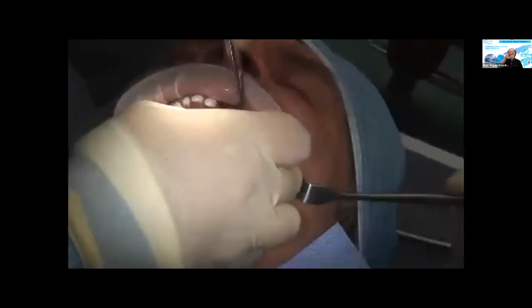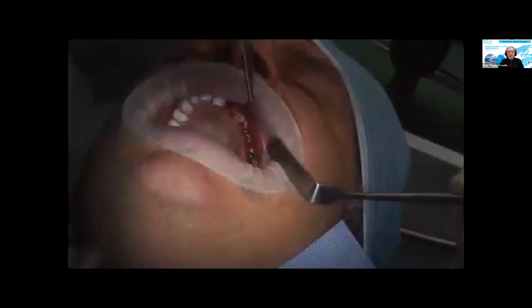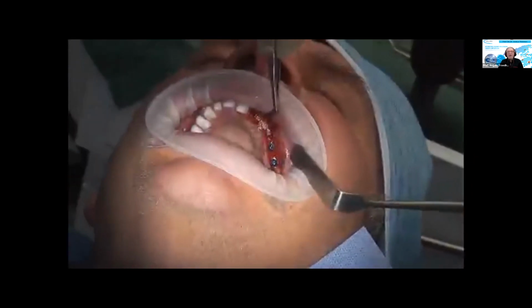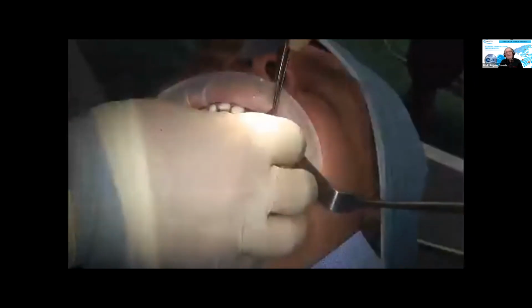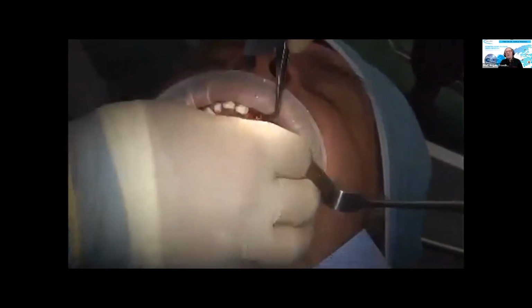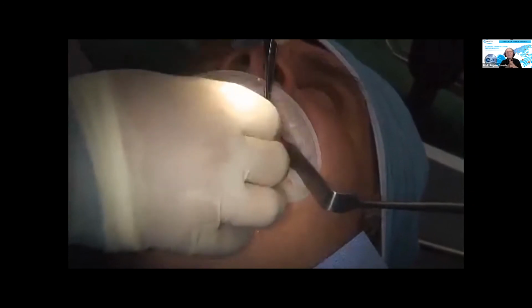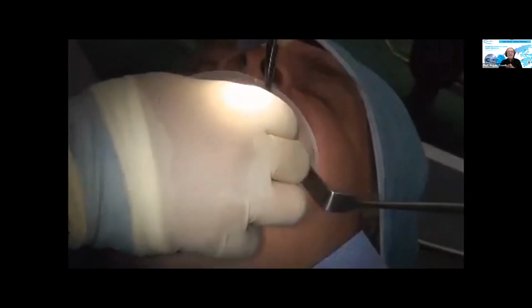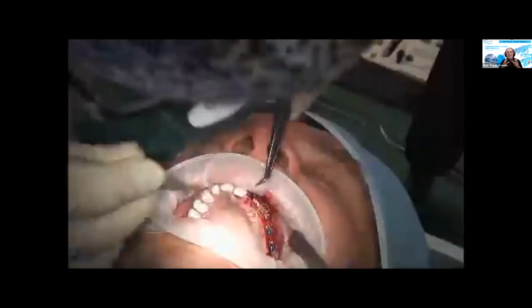Now, of course, in between the two inserted implants in the crest split, we mostly use the self-hardening bone graft material EasyGraft. Why? Because it's the first autologous bone block analog material, because it's self-hardening. Actually, it's beta-tricalcium phosphate and hydroxyapatite or pure beta-tricalcium phosphate in a formulation that allows self-hardening.